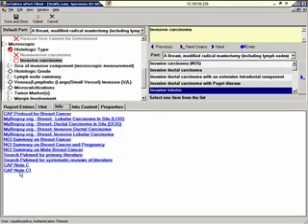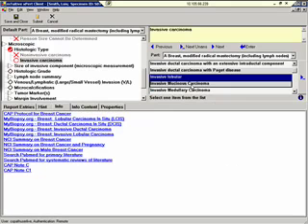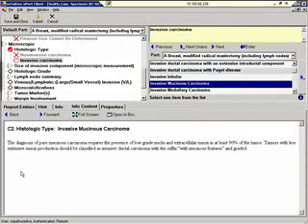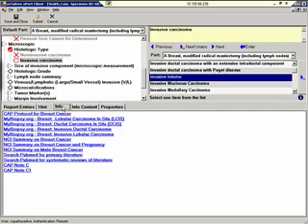As you can see, CapNote C1 is available. CapNote C1 pertains to invasive lobular carcinoma. Now if we highlight invasive mucinous carcinoma, you can see that CapNote C2 becomes available, and that note pertains to invasive mucinous carcinoma. The system can also perform a contextual search based on the data we've input thus far.